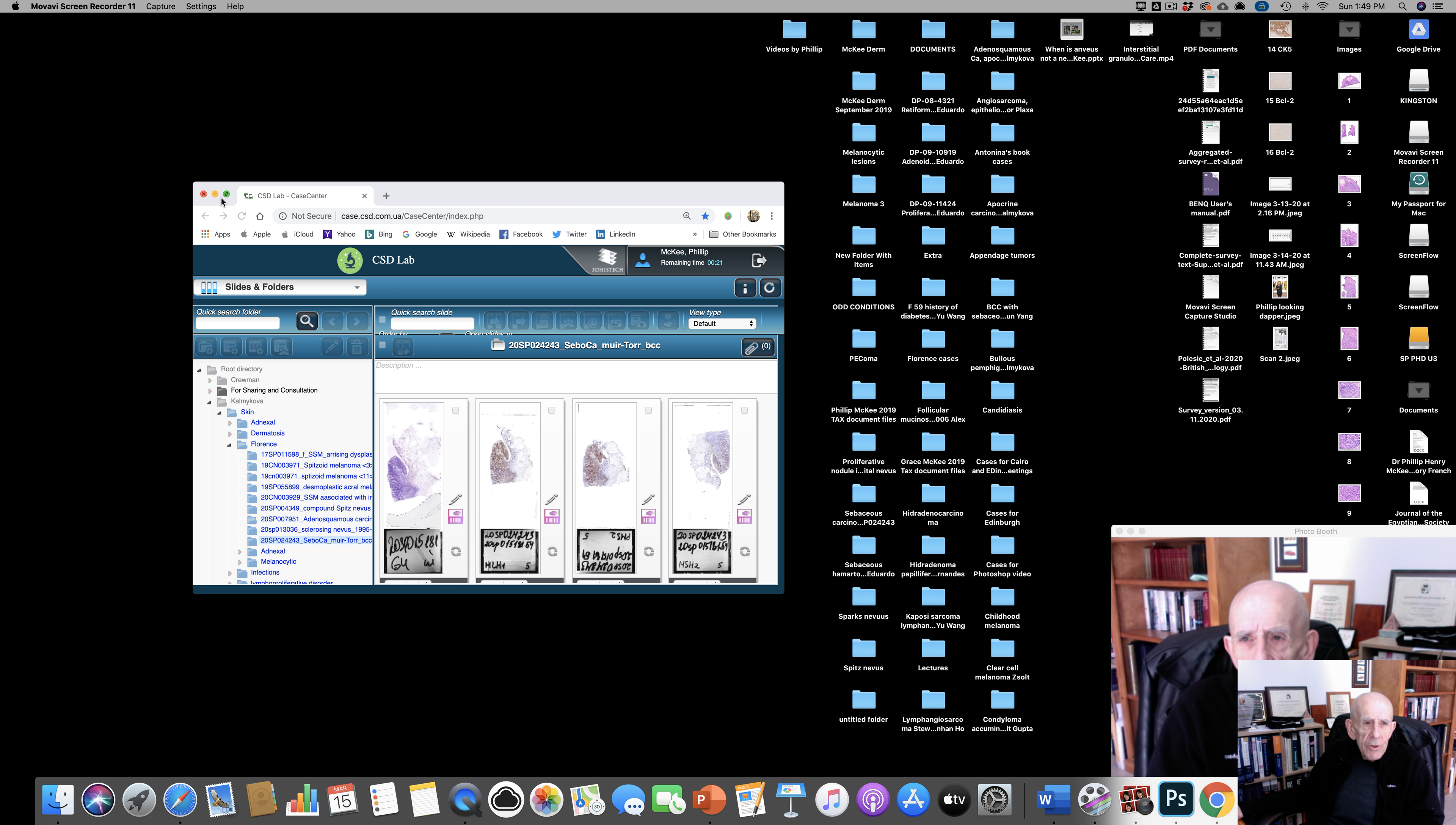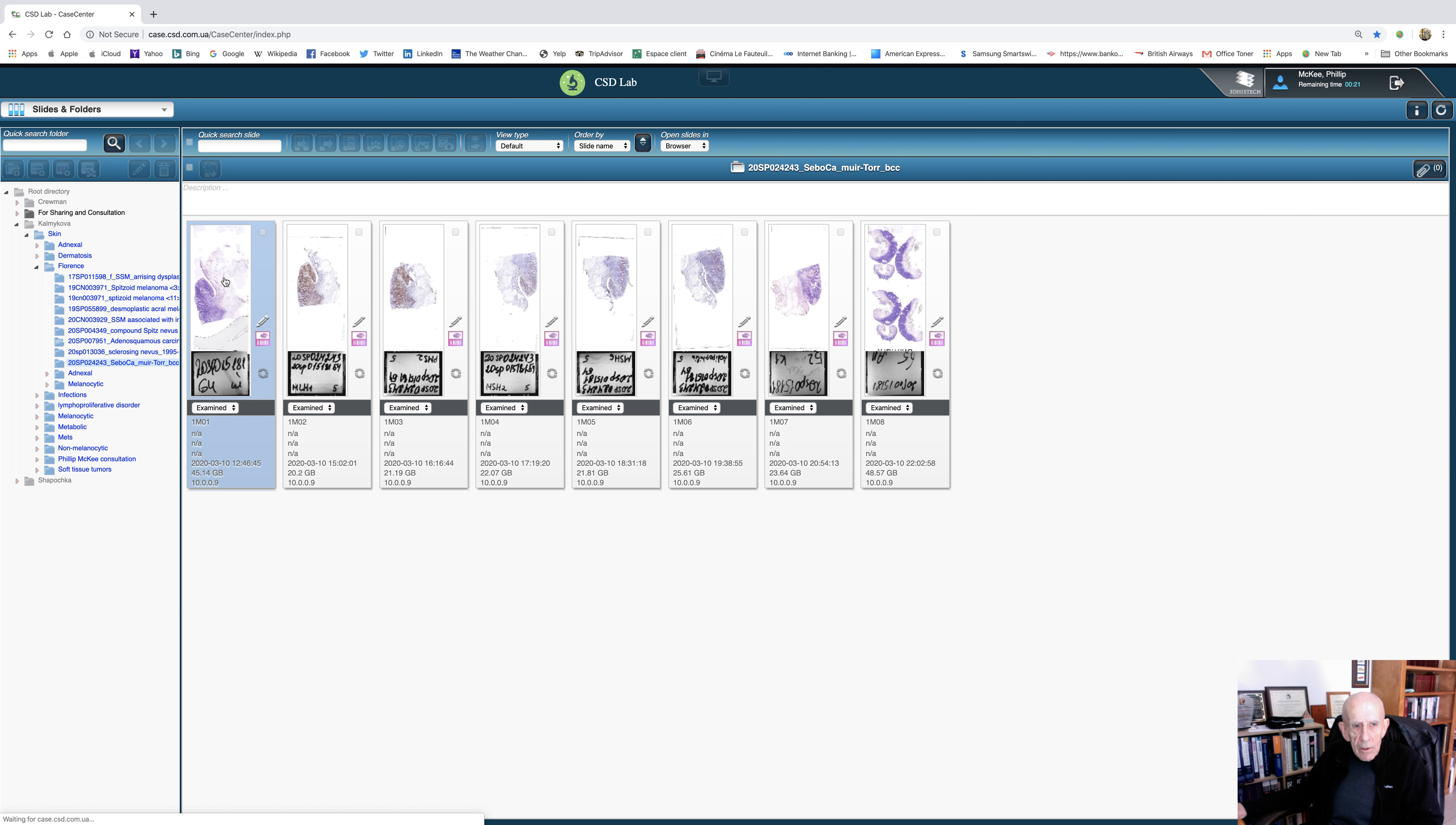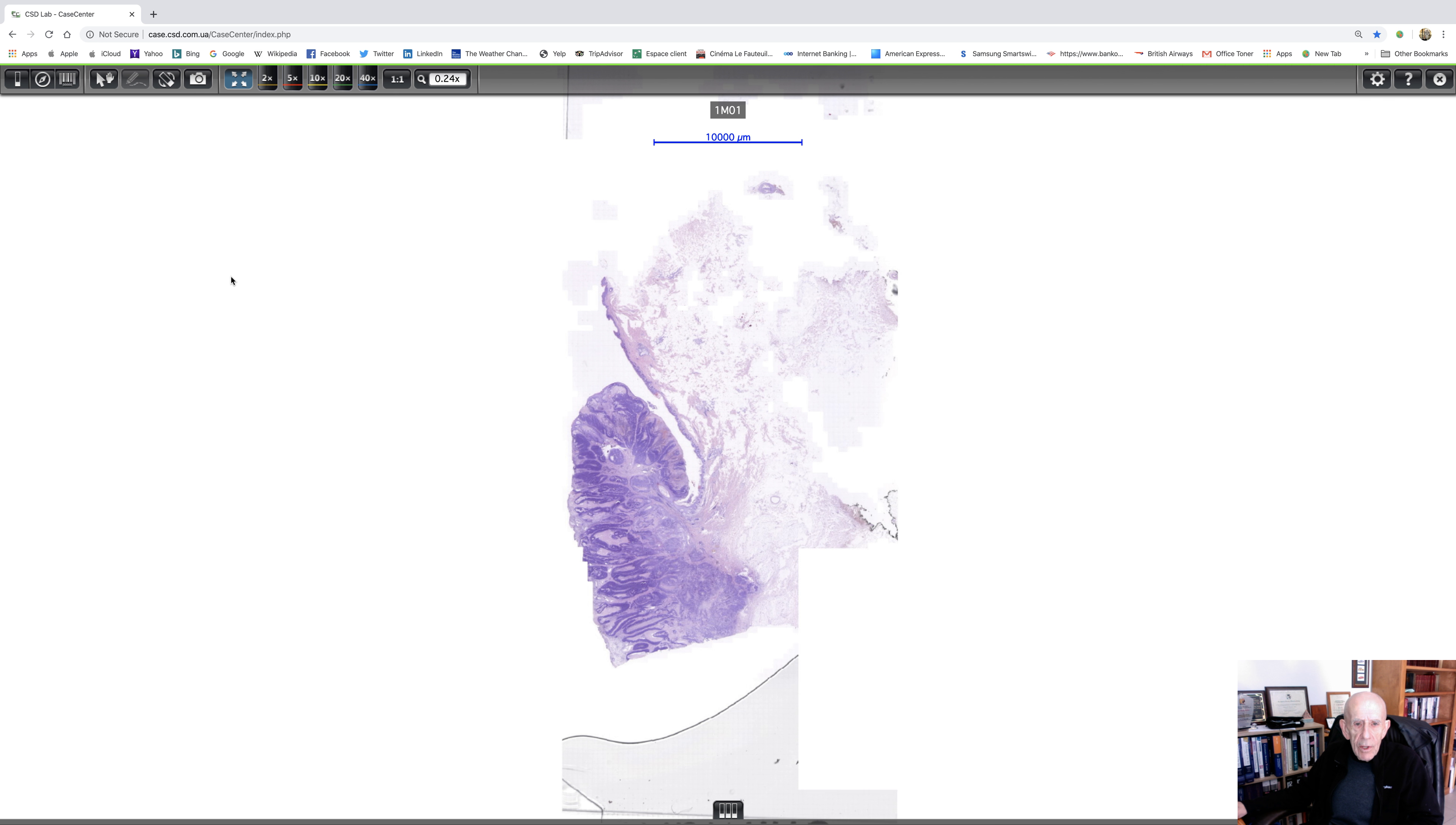I want to share a really fantastic case that Antonina Kalmakova has shared with me. It's such a perfect slide. Let's just see what we can see at the lowest power.